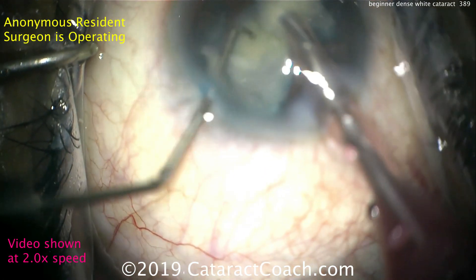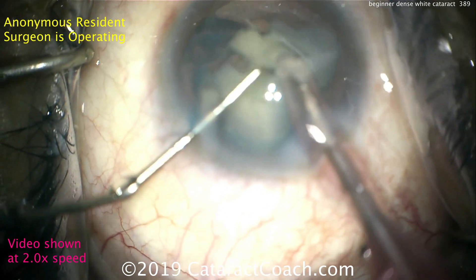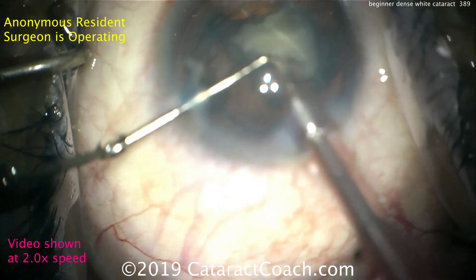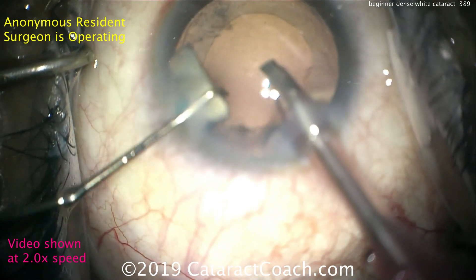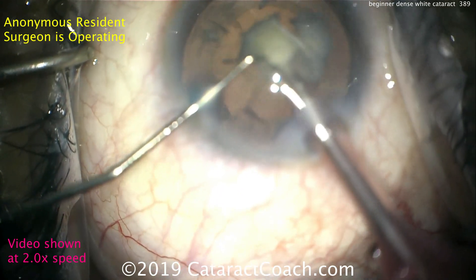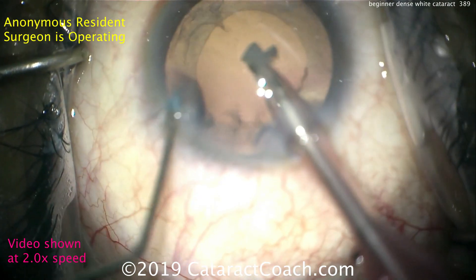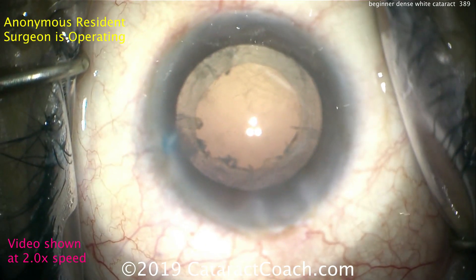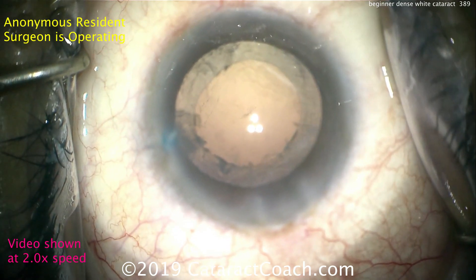Look at the positioning — the eye stays in primary, and the two instruments float and pivot nicely within the incisions. The chopper is doing much more than chopping; it's pushing pieces in front of the phaco probe and helping rotate them. These are advanced techniques, not something you'd expect from a novice. The video was submitted anonymously. If it truly is the beginning of a learning curve, I commend the surgeon for a beautiful technique. If this is a more advanced surgeon, you're still doing a great job.